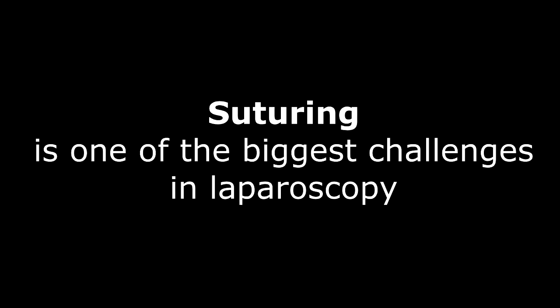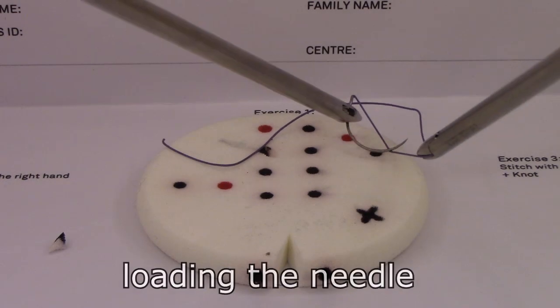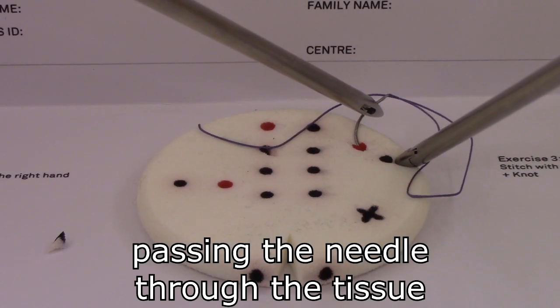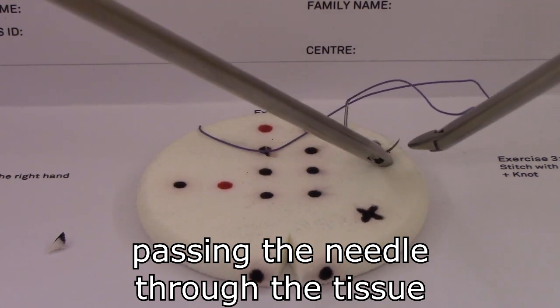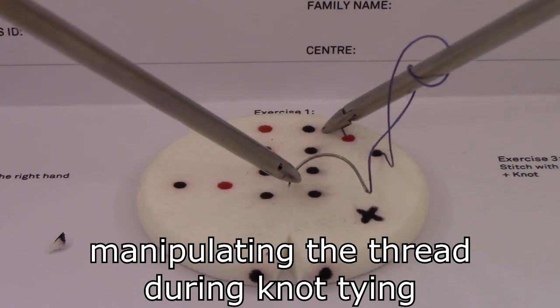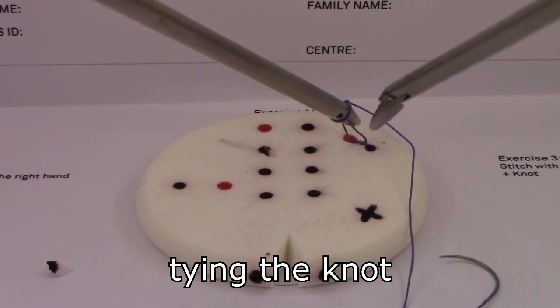Suturing is one of the biggest challenges in laparoscopy. The steps of suturing are loading the needle, passing the needle through the tissue, and knot tying. Loading the needle aims to achieve the correct needle position, passing the needle through the tissue with correct entry and exit points, forming a double loop for the first part of a surgical knot, and finishing the knot with a simple loop.